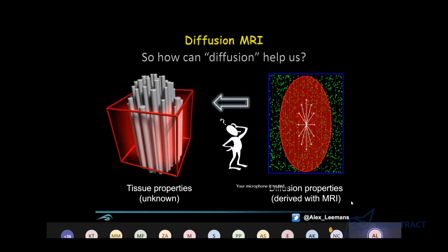And so this is the cool thing about diffusion imaging. You would be looking at a technique where the data that you acquire has macroscopic building blocks, like millimeter-sized voxels, but the process that underlies the acquisition is literally looking at molecules, ensembles of many, many molecules that are probing the tissue.